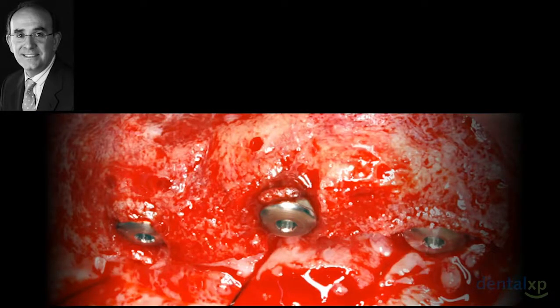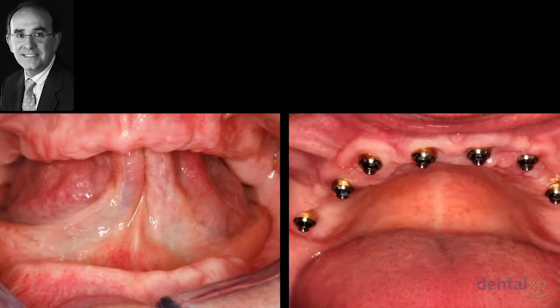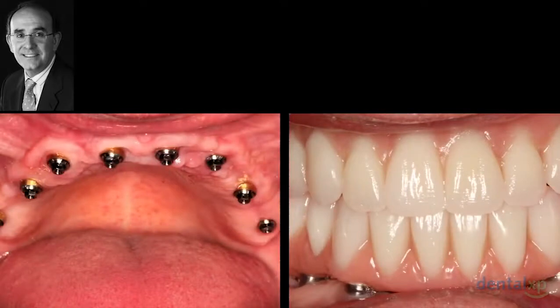My question is, do we need to use this protocol, because I think that this volume of bone is a good result too. This was the older hemiarcade, and we can transform a very narrow biotype into a very thick biotype. In these cases, I always love to screw the prosthesis, and this was the result before and after.